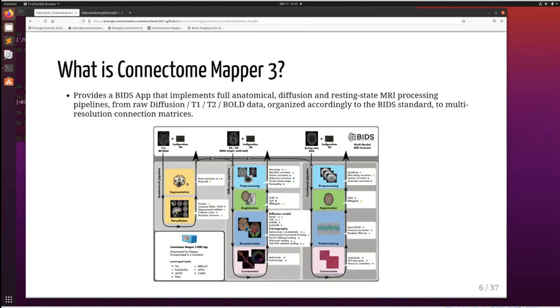You get three different pipelines, each providing an interface with tools well-adopted in the community. Everything is powered by Nipype, so all processing pipelines are Nipype workflows — similar in design principle to fMRIPrep — providing a nice framework to track execution, resume at a specific step, or re-run from the point where a parameter changed. The diffusion pipeline takes output from the anatomical pipeline, and the same for the functional pipeline, meaning both need the brain parcellation to map structural or functional connectivity.